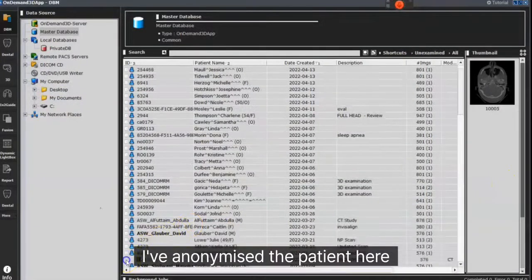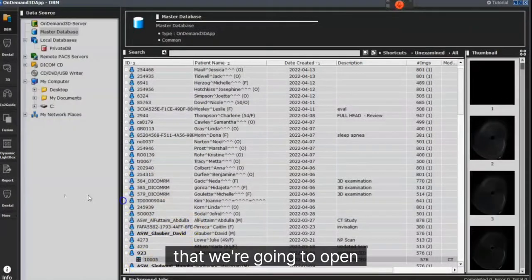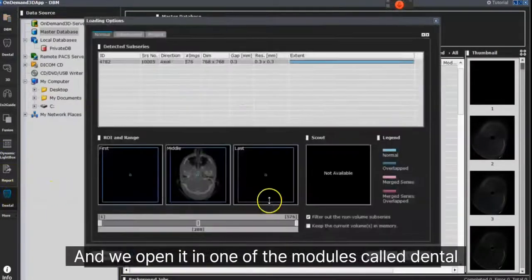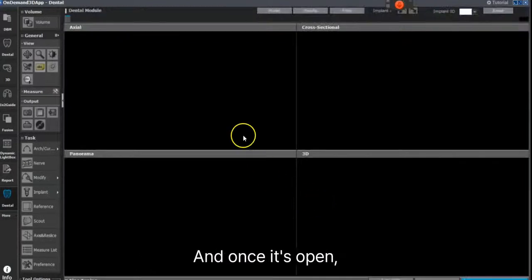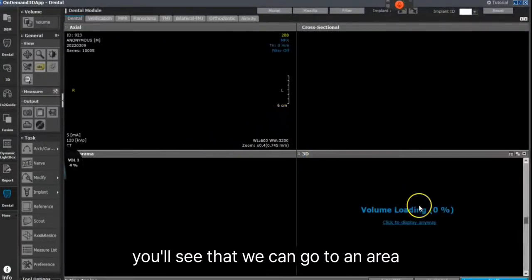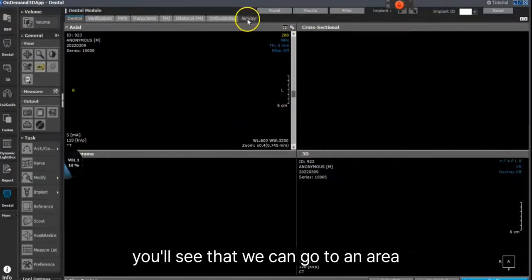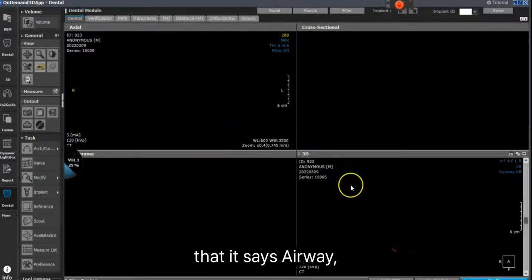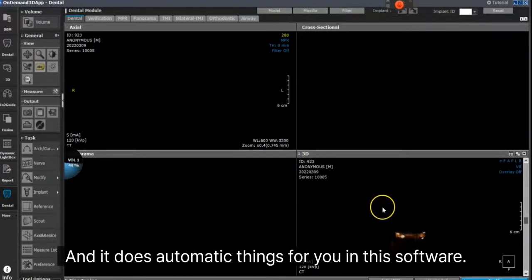I've anonymized a patient here that we're going to open, and we open it in one of the modules called Dental. And once it's open, you'll see that we can go to an area that says Airway, and it does automatic things for you in this software.